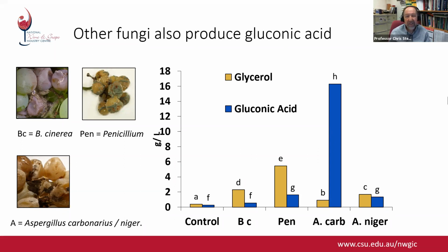So my comment on the kits are, yeah, they're an indicator of fungal spoilage, but maybe there's not great specificity there if we've got a mixture of bunch rotting fungi in the vineyard. And very often you don't. Very often it's just botrytis, it's just one thing.